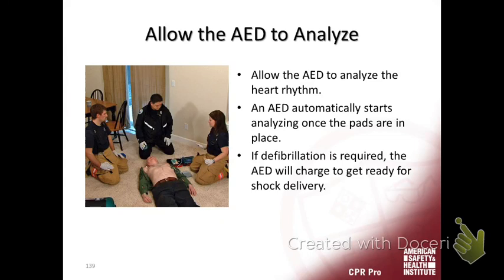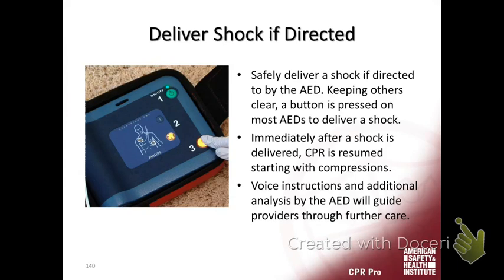You've got the pads up, plugged in, and turned on. It's analyzing. Make sure you stay clear and don't move the patient — movement can affect the rhythm reading. Let it analyze. Once it analyzes, it's going to direct you to shock if it's a shockable rhythm. If it's not a shockable rhythm, it's going to prompt you to start CPR, because we've already checked and they don't have a pulse — we know they're in cardiac arrest.